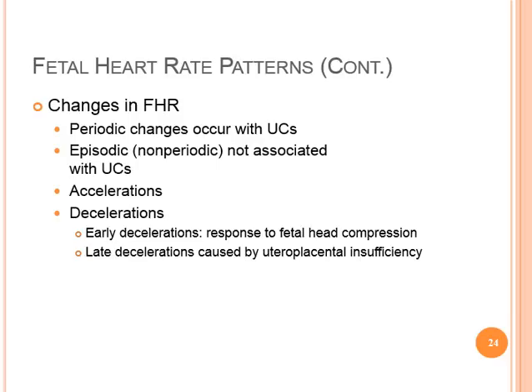Acceleration of the fetal heart rate is defined as a visually apparent, abrupt increase in fetal heart rate above the baseline rate. The peak is at least 15 beats per minute above the baseline, and the acceleration lasts at least 15 seconds or more. So you need a 15 by 15 for it to be considered an acceleration.